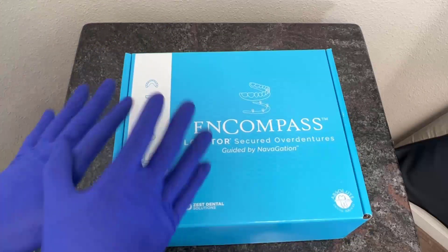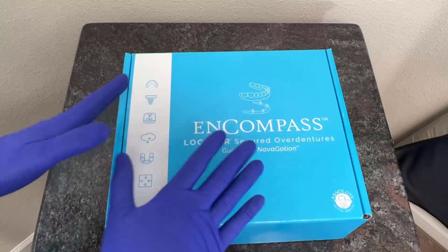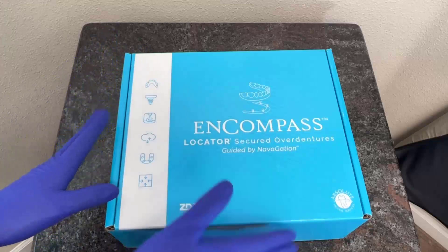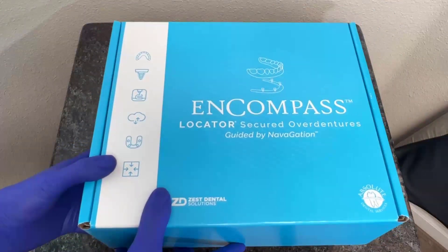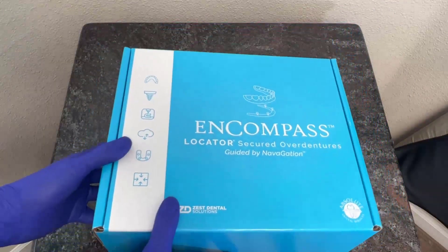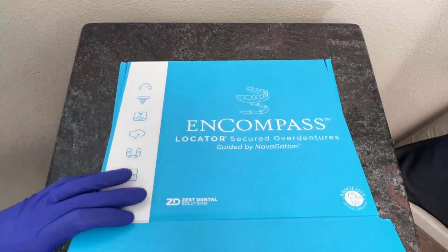If I have a patient that would be interested in learning a little bit more about what their teeth are going to look like, or tell me a little bit about this digital thing that you keep telling me about, I can hand this box to them and say: in here is your new teeth and all the information related to your digital implant denture journey. The patients can be really impressed by the aesthetic appeal of it, especially from the presentation quality.